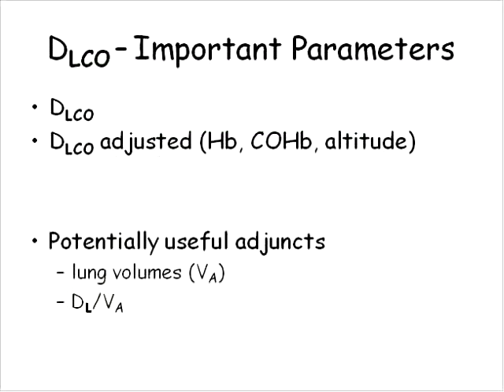The next probably most important set of parameters that we should look at would probably be the DLCO, and that's not in the exact order that the ATS algorithm suggested that we just looked at, but I think because the DLCO has such clear indications in terms of what it can be used for in terms of answering the clinical question, that it's appropriate to consider it next.